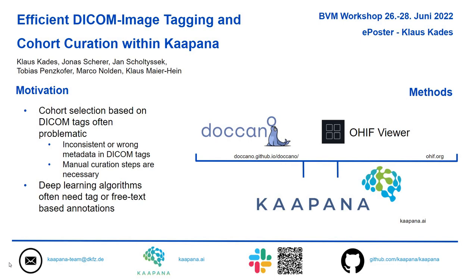Also, many deep learning algorithms need a tag or free text-based annotations next to the pixel-wise annotations. We provide a solution with which you can very quickly go through DICOM images and add those tag or free text-based annotations.